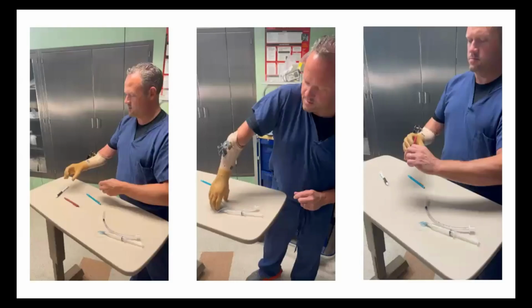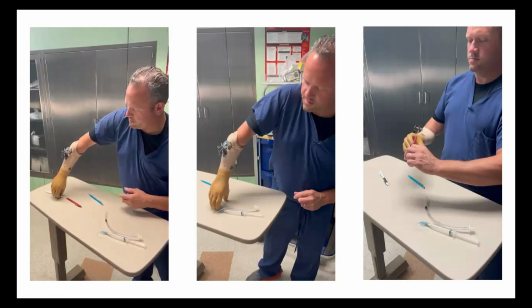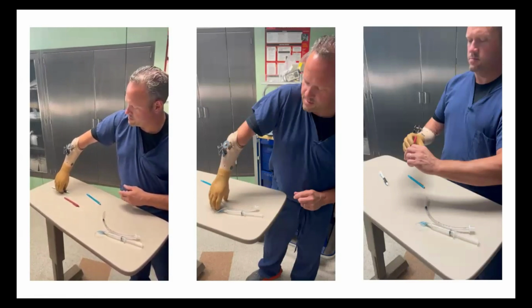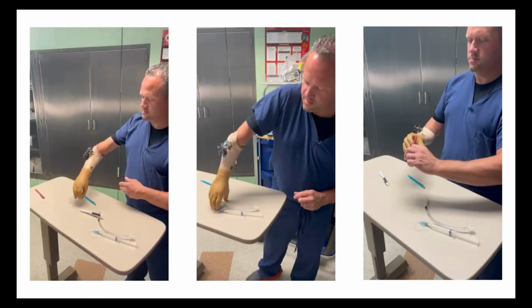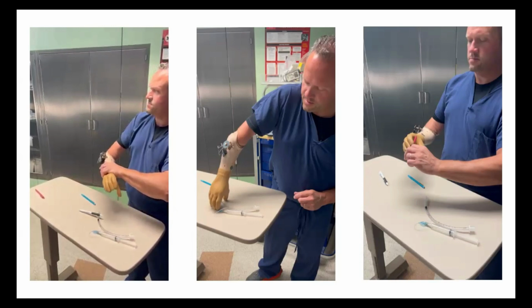For example, our end user Brett specified a lot of struggles that he experiences on a day-to-day basis with his own prosthetics. Some of which include simply picking up a pencil. It can be very difficult and take several attempts to get done, since most prosthetics mainly specialize in a 3-jaw chuck, just moving the first two fingers and thumb, so it can be very difficult to position properly to pick up a pencil and other thin objects like that.